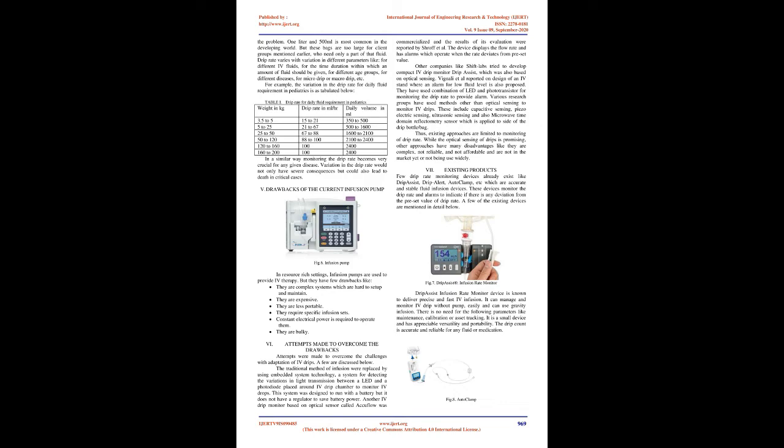Composition, concentration, viscosity of fluid in the reservoir. Changes in patient's position. Height of reservoir above the patient. Occlusion of the device, e.g. due to an inflated BP cuff. In addition, the variation in the cross-section of the patient's vein can affect the flow rate. Reduction in pressure as the reservoir volume decreases will decrease the flow rate. Patients occasionally adjust the roller clamp or other parts of the delivery system.